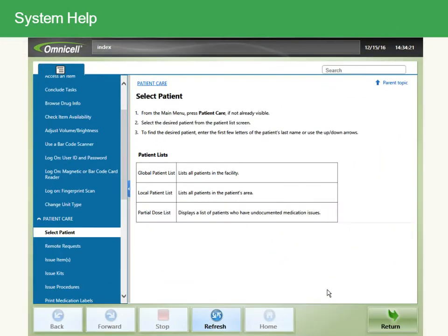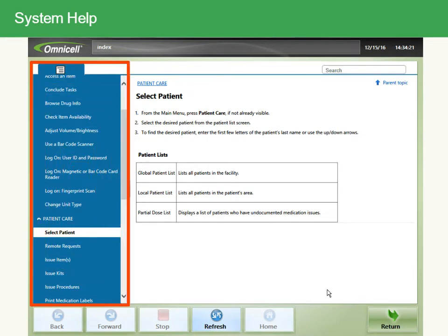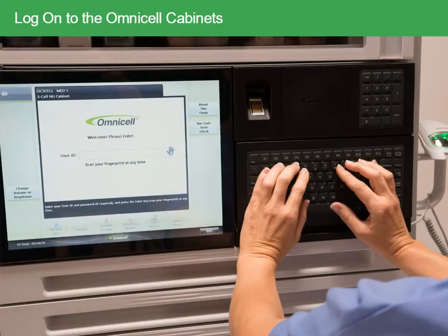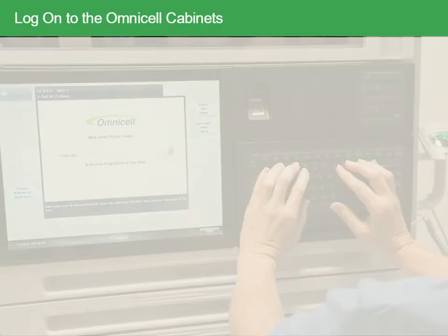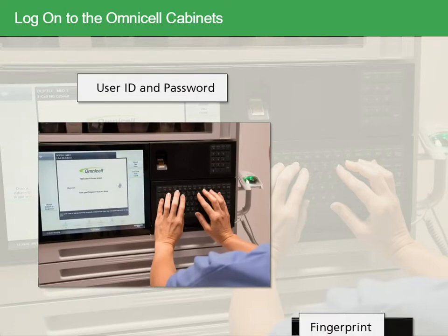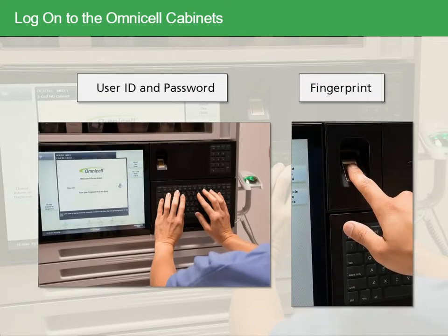Once the guide opens, you may scroll through the help sections. If you're looking for an answer to a particular topic, use Search to find it. To log on to an OmniCell cabinet, you can use your user ID and password or a fingerprint.